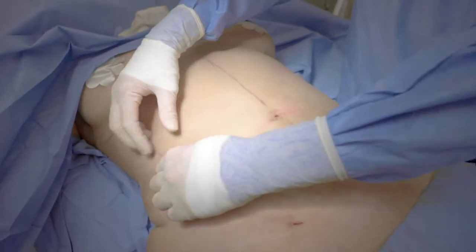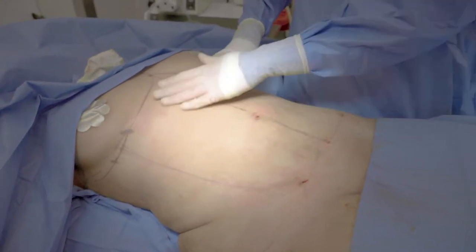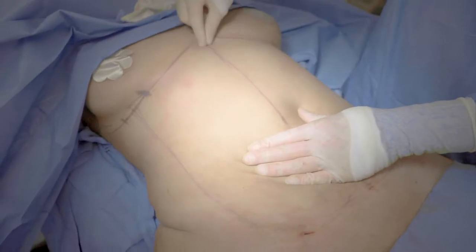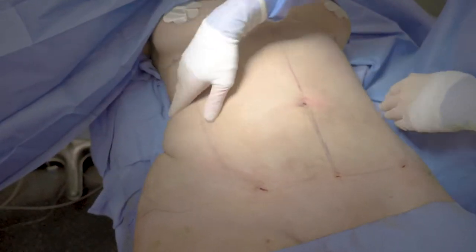We just finished lipo on the stomach. Took about a liter of fat. I'm pinching — this is mostly skin left. I'm pretty sure I took all the fat and sculpted her a little bit. Everybody's different, but the lines will come out in a few weeks, a few months. Now we're going to turn her to the side and work on the waistline.